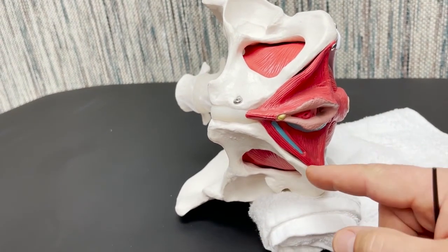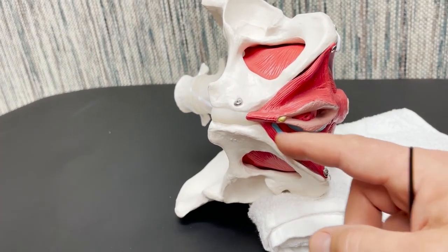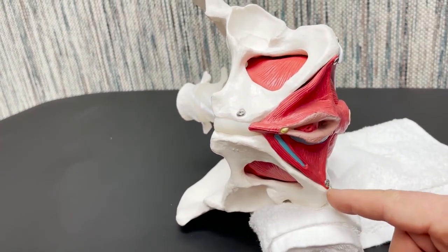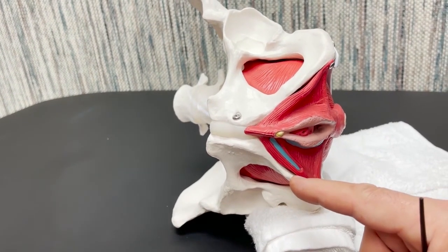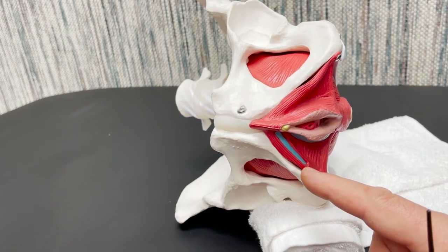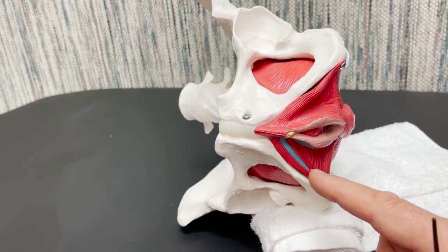So we have to make sure that we go inferior to the ramus itself to land into ischio-cavernosus. Again, midpoint between pubic symphysis and ischial tuberosity. No more than 3 centimeters necessary to land into this tissue.